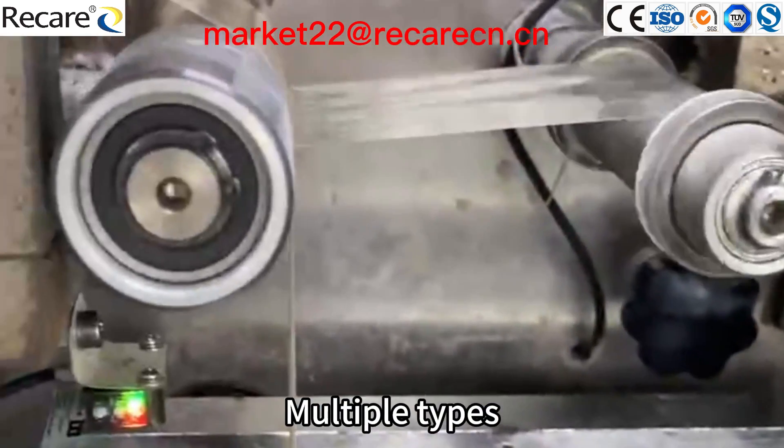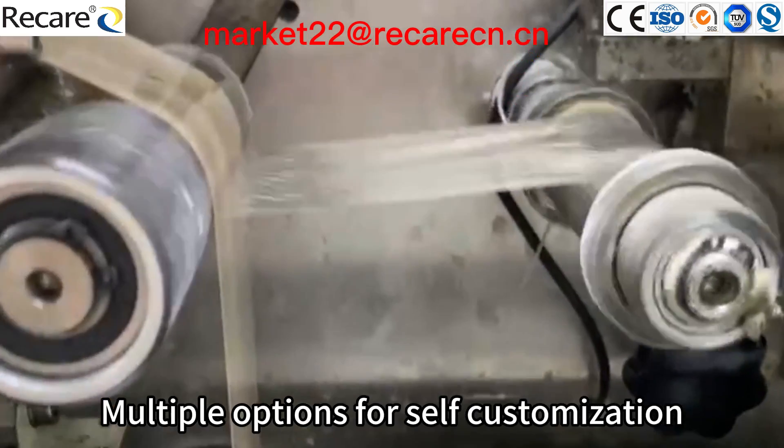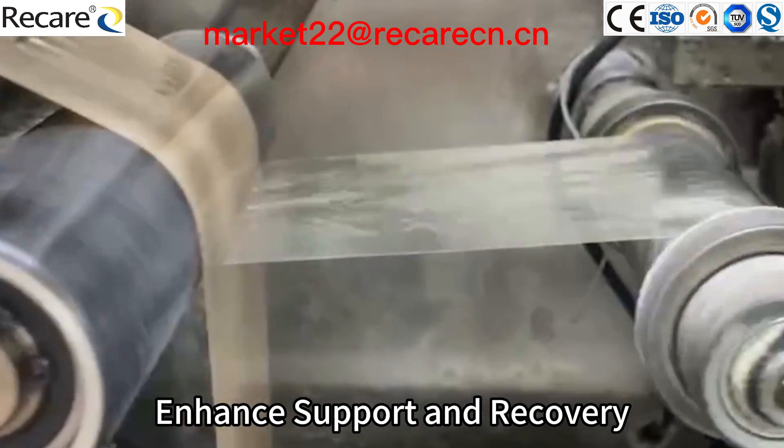Multiple types and options for self-customization. Elastic stretching to enhance support and recovery.